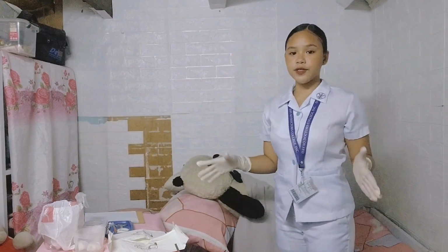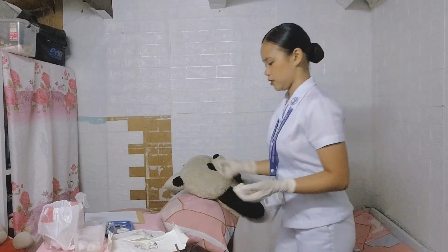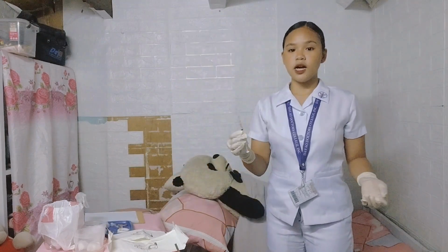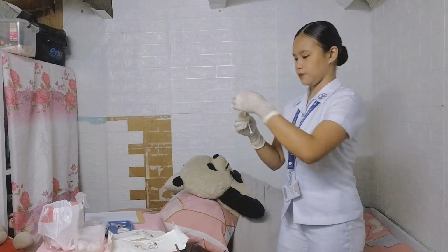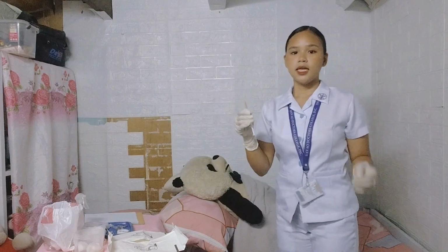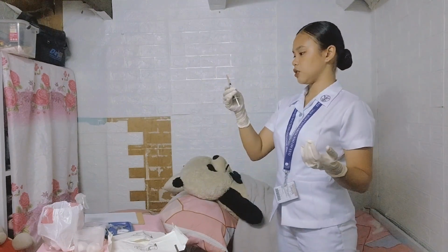After that, prepare the syringe for the injection. Now remove the needle cap while waiting for the antiseptic to dry, and expel any air bubbles from the syringe.